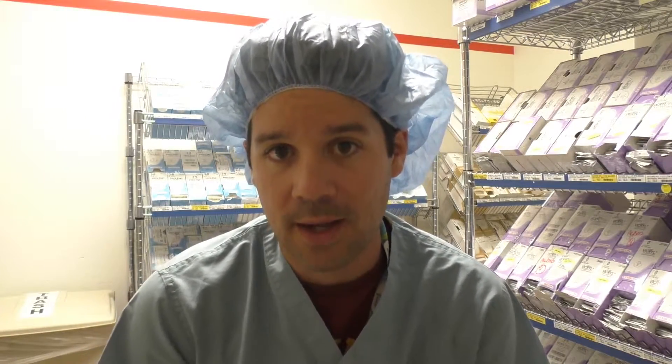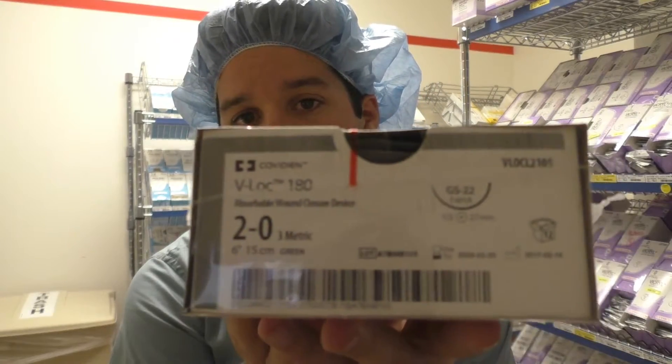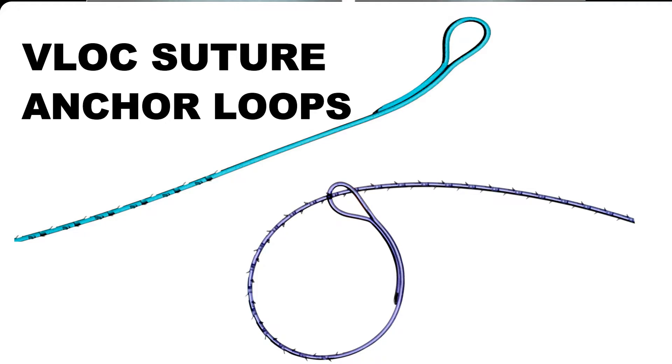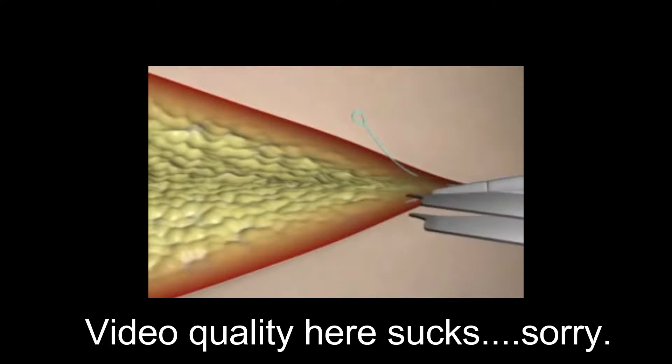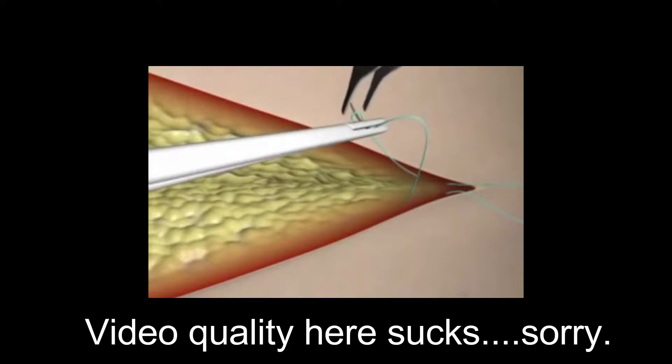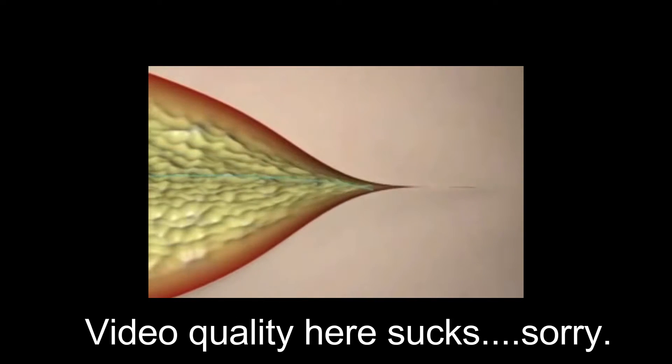The next suture I want to talk about is one that's used in robotic surgery a lot, and that is the V-Lock suture. What's interesting about this suture is that it is very similar to the Quill and Stratafix in that it is a barbed suture. But the main difference is that the end of the suture has a loop built into it. So the surgeon can actually throw like a cow hitch knot as his first throw, and then continue on and sew up whatever they're working on, and the barbs will keep that suture in place.